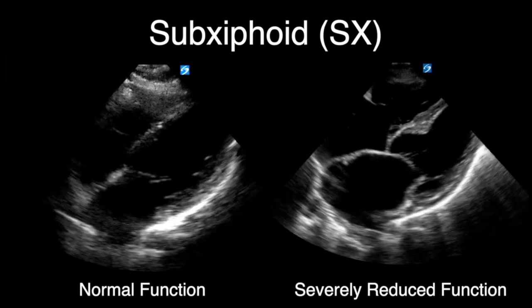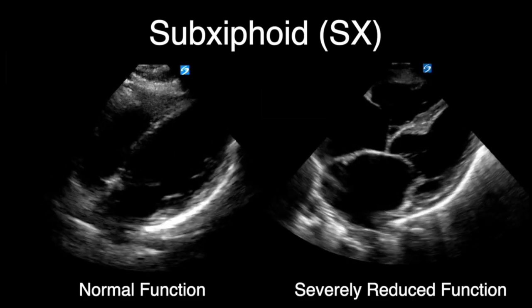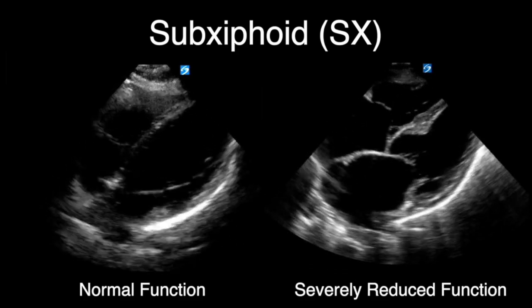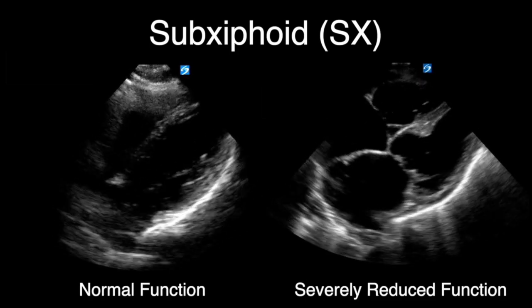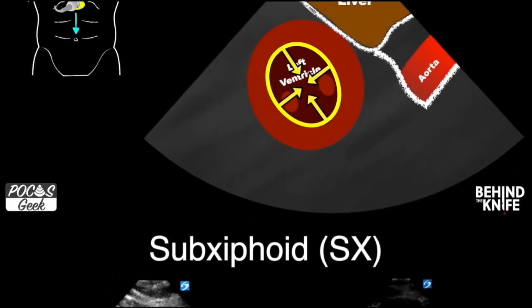We can also see on this one on the right, look how big those atria are, right? Those are very dilated. That's telling us that there's some significant heart failure going on. There's probably some valvular insufficiencies between the chambers. So we want to be cautious anytime a chamber's big about giving fluid and fix the underlying issue.